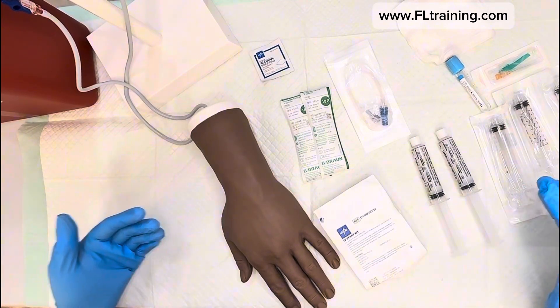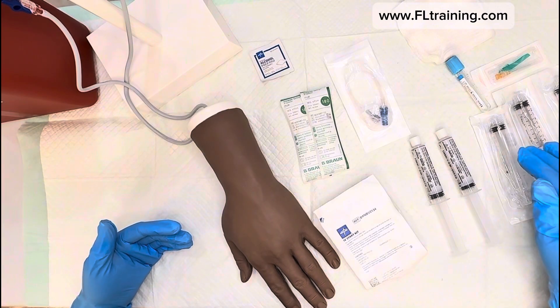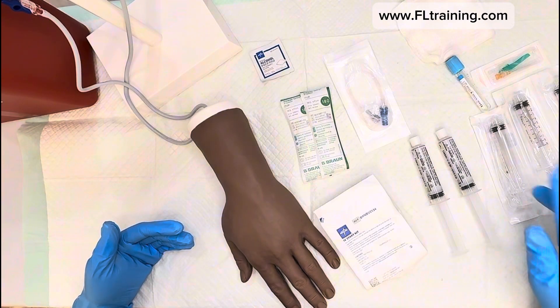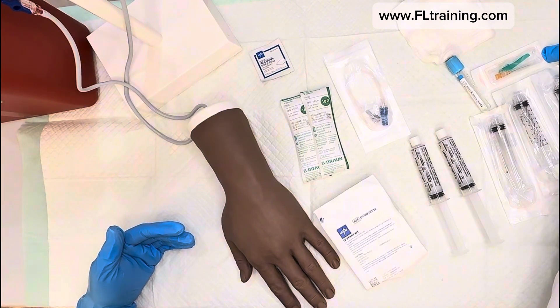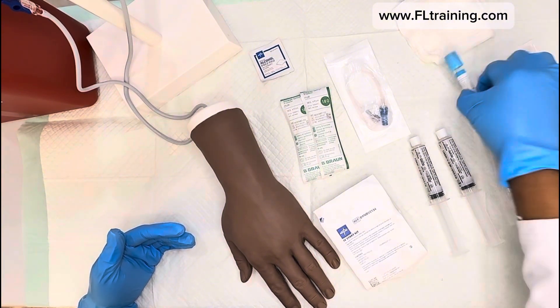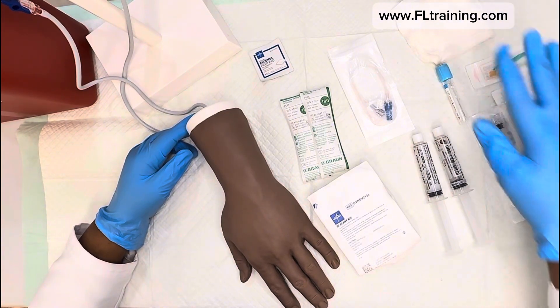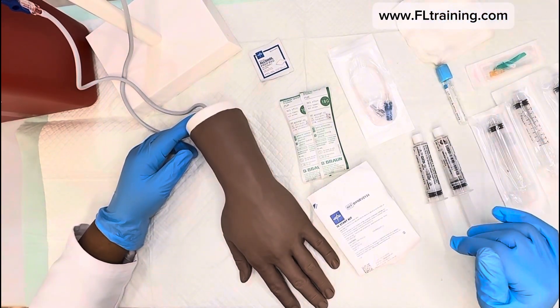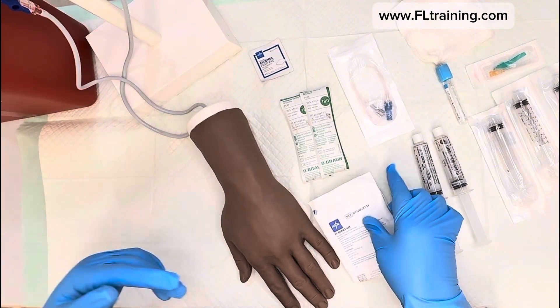We're going to use those syringes to draw a lab. Whenever you're starting an IV, depending on your facility, it may be policy to allow you to draw labs from a fresh IV — but check your policies. Because some patients are bleeders, I like to have more gauze than necessary. Let's go ahead and get started — our patient has given us permission.